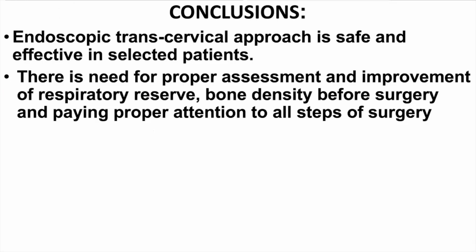So to conclude, the endoscopic transcervical approach is safe and effective in selected patients. There is a need for proper assessment and improvement of the respiratory reserve and bone density before surgery, and one should also pay proper attention to all steps of surgery.